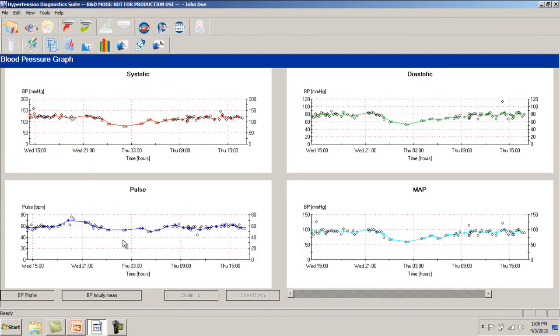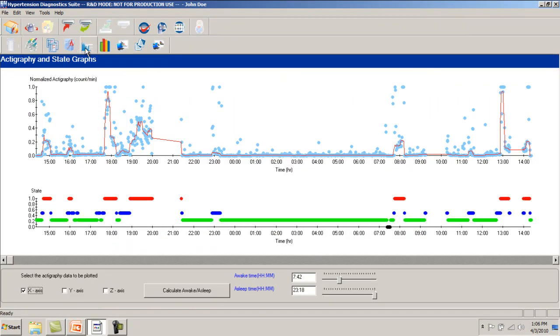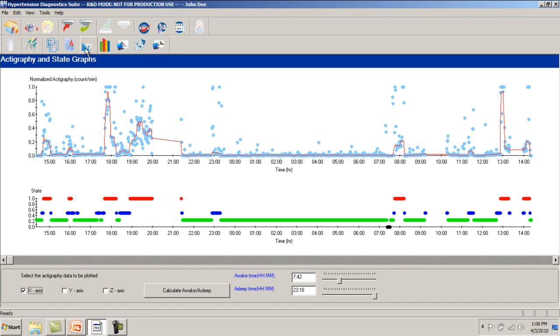The actigraphy view displays the information obtained by the built-in accelerometer. This information is used to determine the activity level during the monitoring period and automatically sets the awake and asleep time periods for each ABPM procedure.